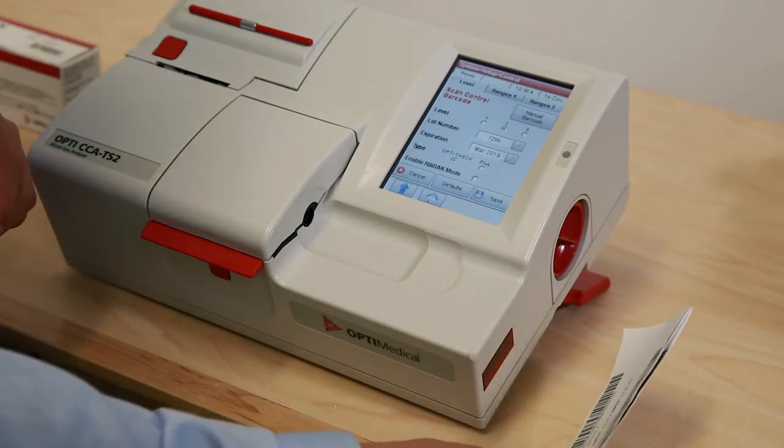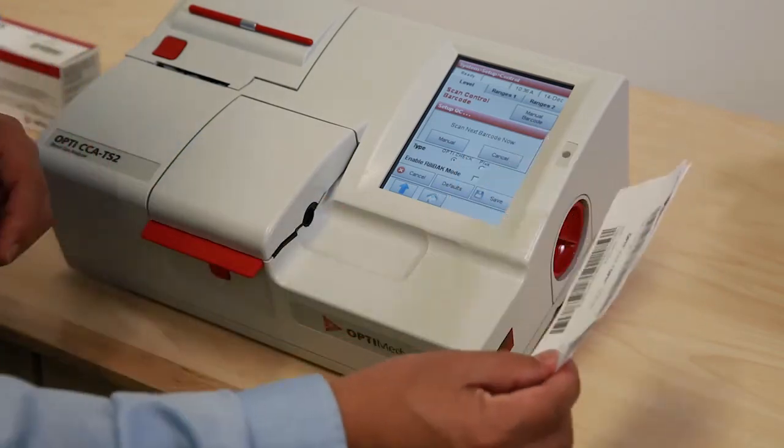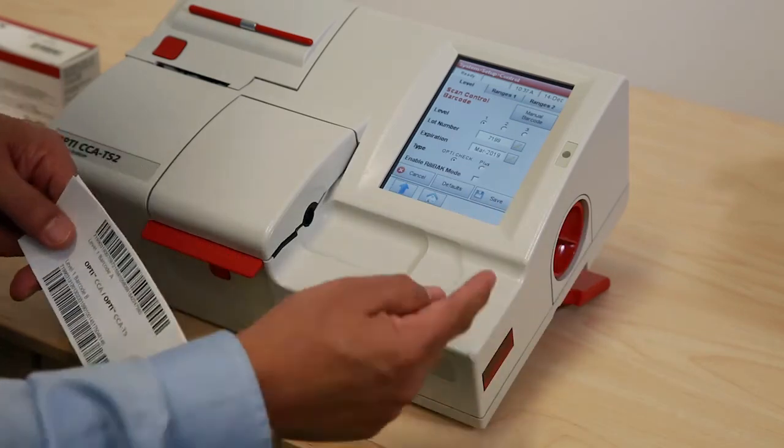Make sure you are covering the whole light with the barcode. Then scan next and press the save button.